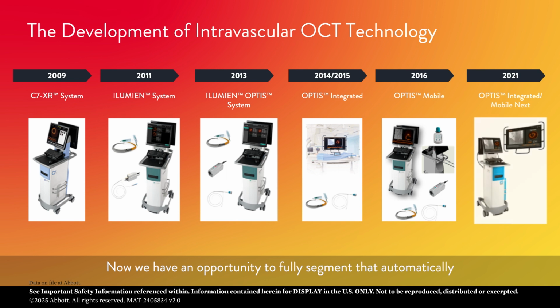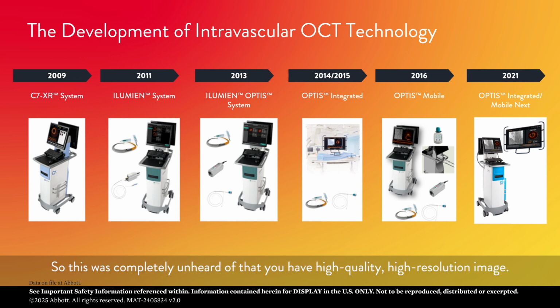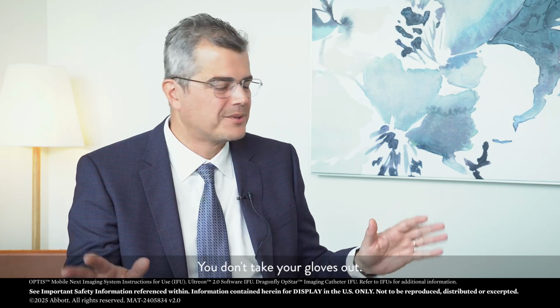Now we have an opportunity to fully segment automatically 75 millimeters of vessel on the fly, right? So this was completely unheard of, that you have a high quality, high resolution image. You don't take your gloves out.